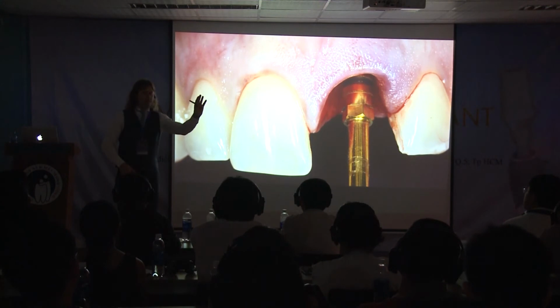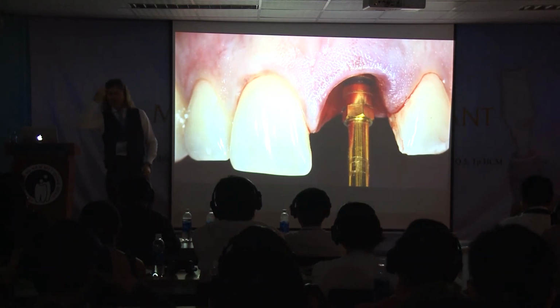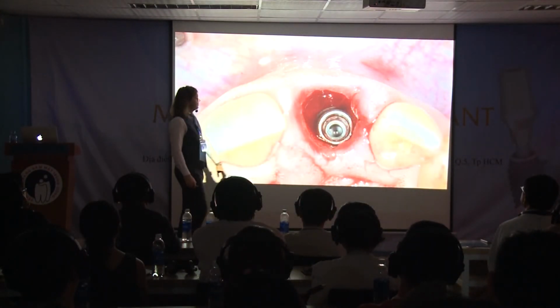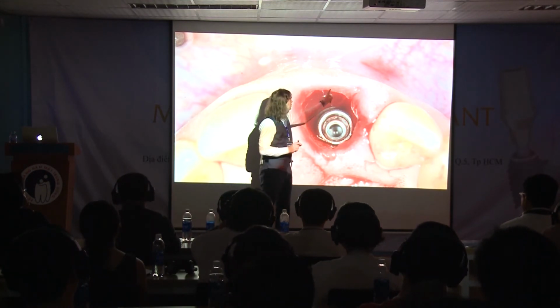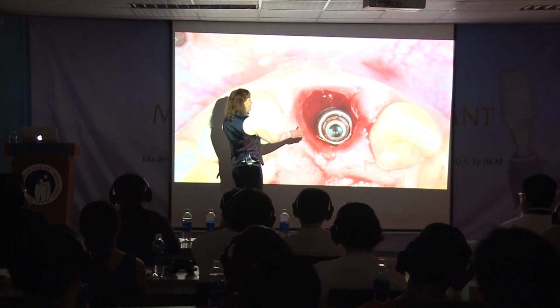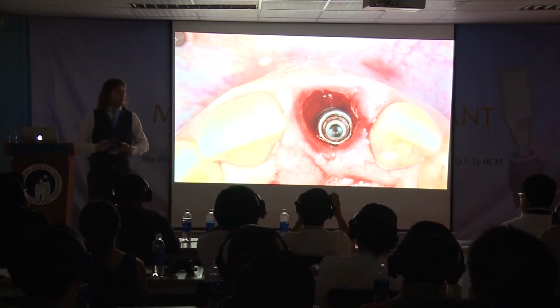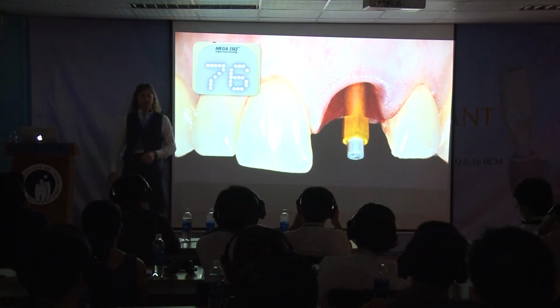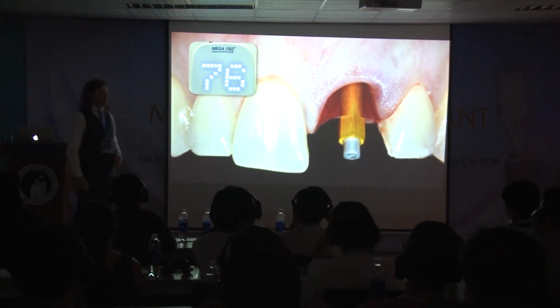Another time we take this number 4 and we write it on our post-it that is still here. Okay, keep your post-it here. So, palatal positioning, slightly distal, in correspondence to the zenith, and little convergent, as the natural roots are, the same. It's very good stability. Remember that torque is not stability. We will see this later.